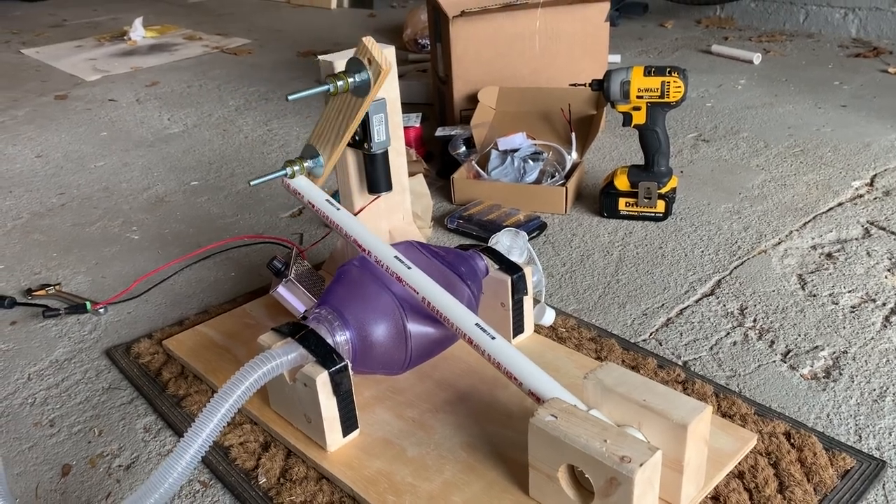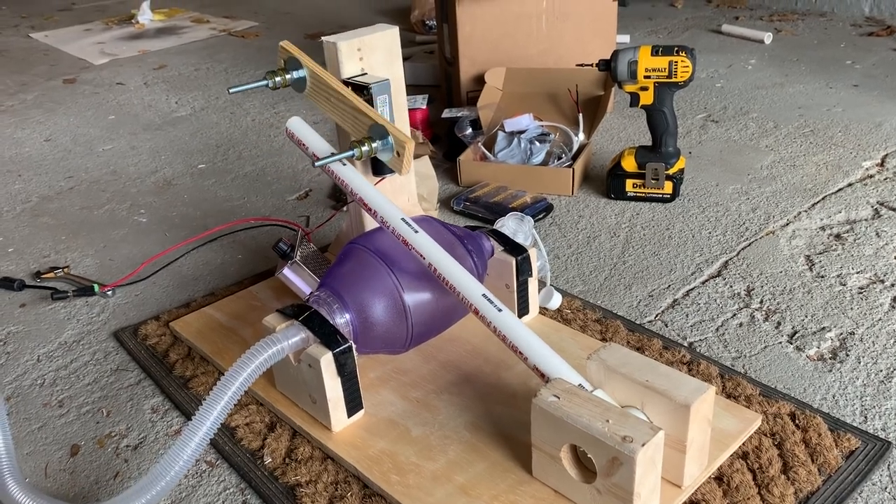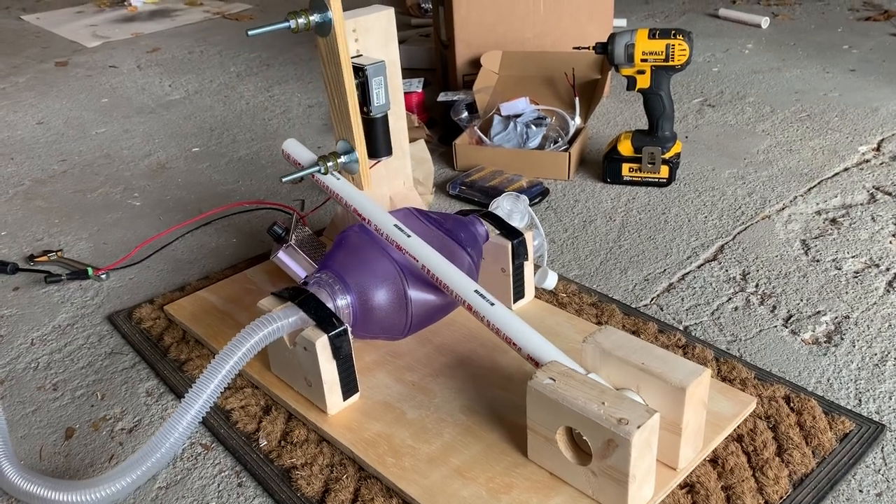As you can probably see just by looking at this, this is a pseudo-ventilator that is built around a bag valve mask, or ambu-bag, as some of you folks may have heard about it.